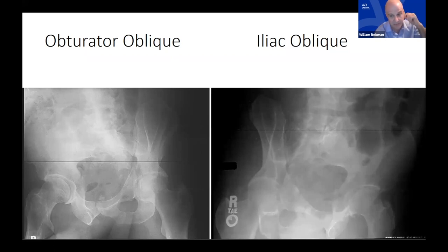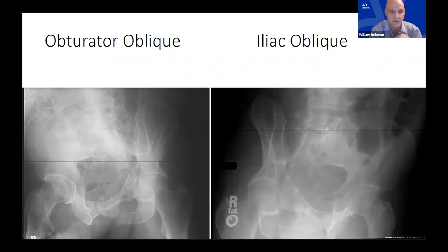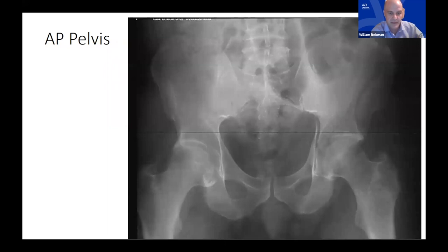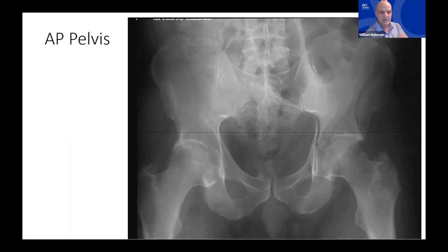Here's the AP pelvis. Start thinking about what type of fracture this might be and formulate your answer. Then ask: are the iliopectineal and/or ilioischial lines disrupted? On the AP radiograph you can see something is disrupted, but it's hard to tell which lines specifically, so we look at the Judet obliques — the obturator oblique and the iliac oblique.